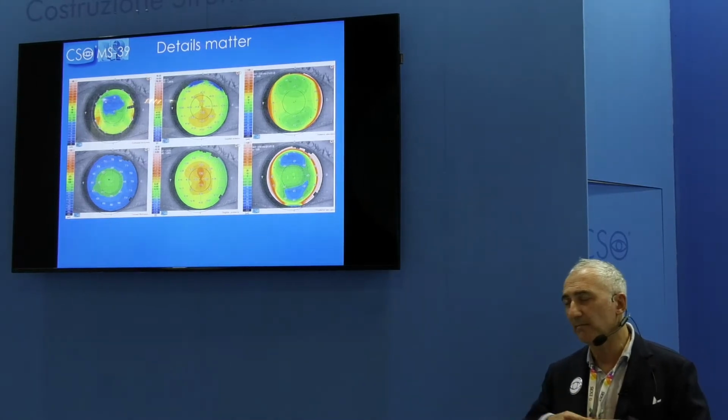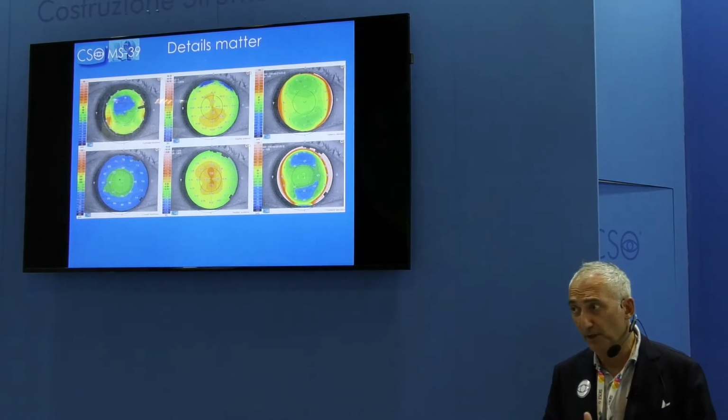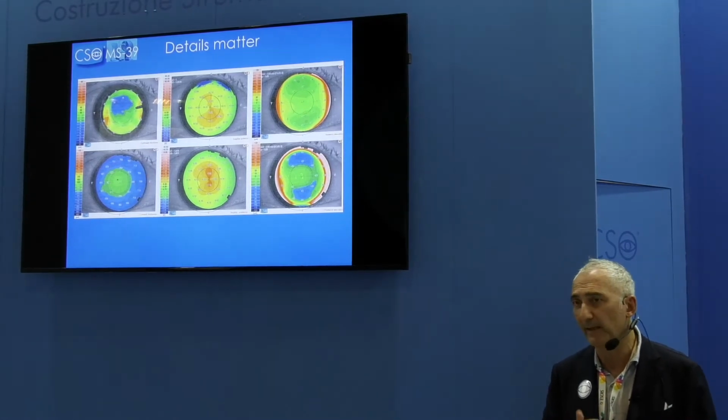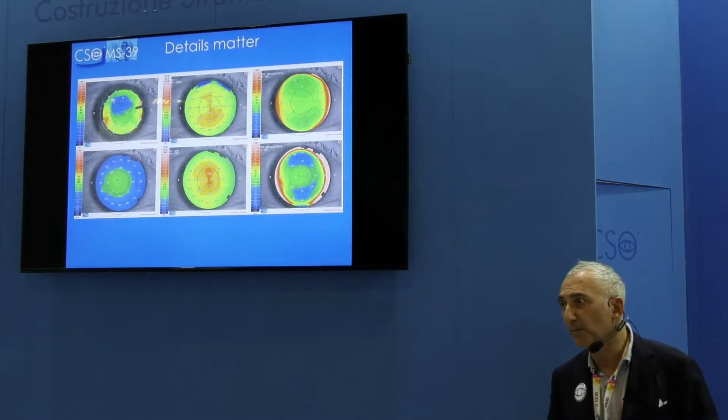And then also in the follow-up, after the warpage caused by the contact lens, we can precisely check, not just guess, whether in 10 days or a couple of weeks the warpage will be over. And only when it is over will we be able to make perfect measurements.